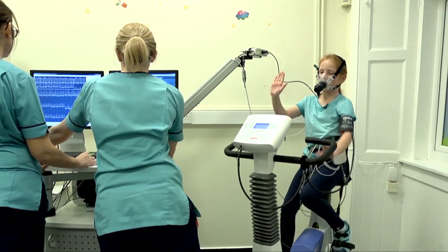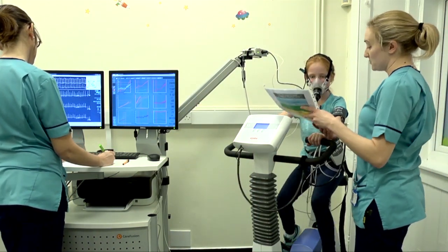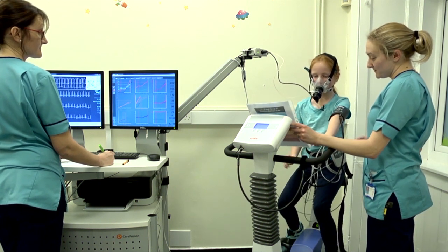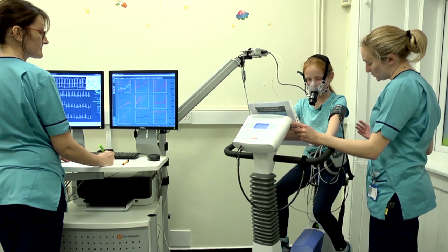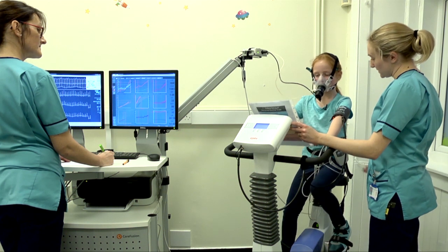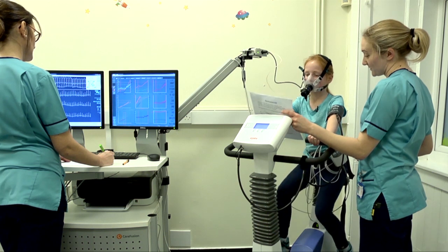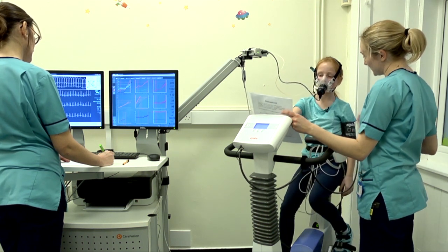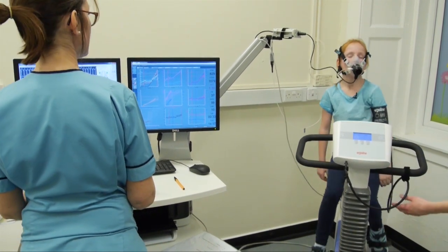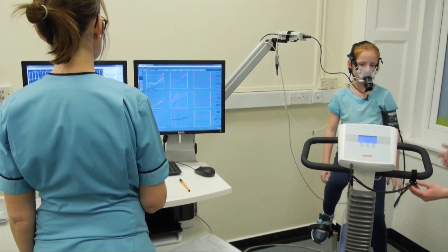Well done. So that's it — keep them turning now. I've made it nice and easy to pedal again. Now can you point to a number and tell me how breathless you are feeling? Just keep your legs turning — we just need to keep them going just to get everything back to normal. How hard would you say you were working at the end? Ten. Feeling okay? Yeah. You did brilliantly. We're going to slow our legs down but just need to keep them turning for a few minutes just to let everything get back to normal.